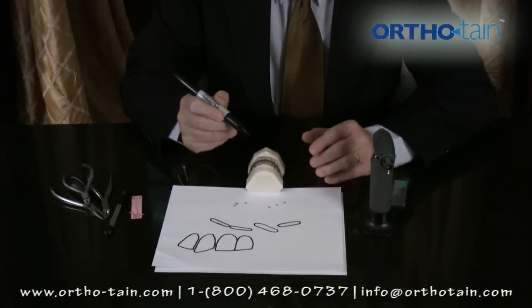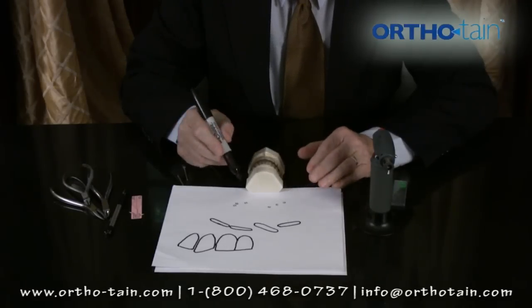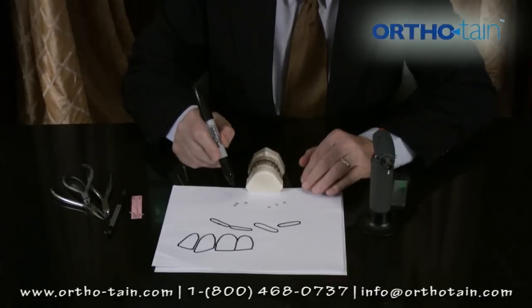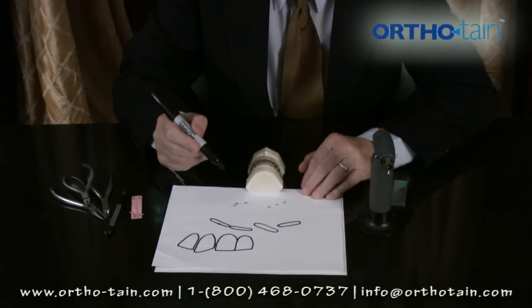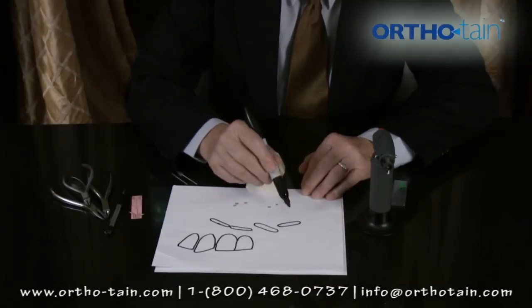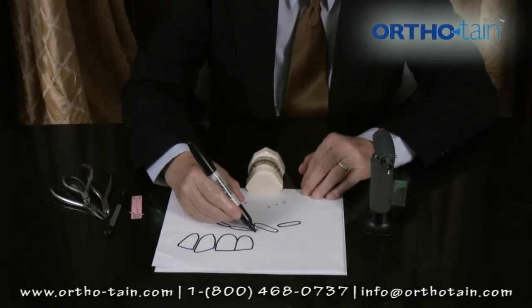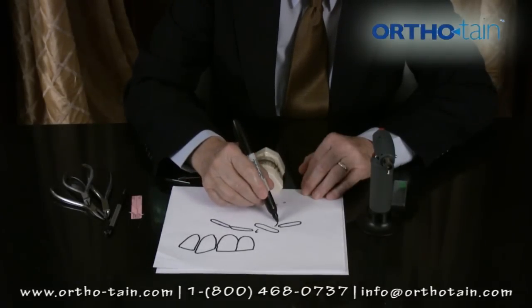Sometimes, if you give us a diagnosis to do, we'll send you back a sheet showing you where you should put these cleats. Generally, we allow the case to straighten almost completely before we do that. But a case like this, looking occlusally on the four lower incisors, this tooth really should be rotated in this direction and this direction.